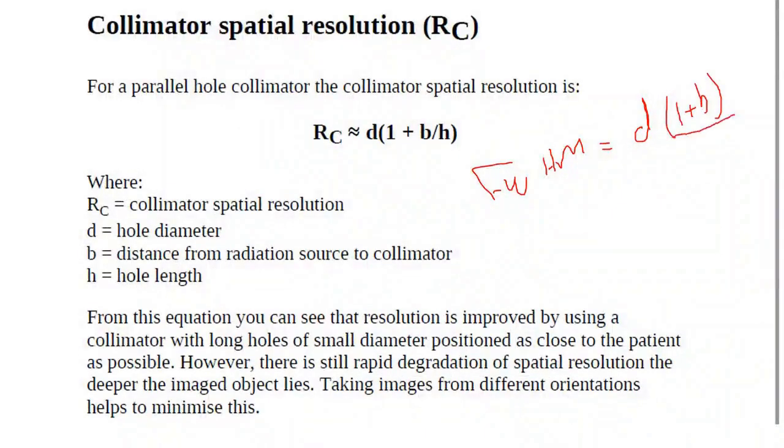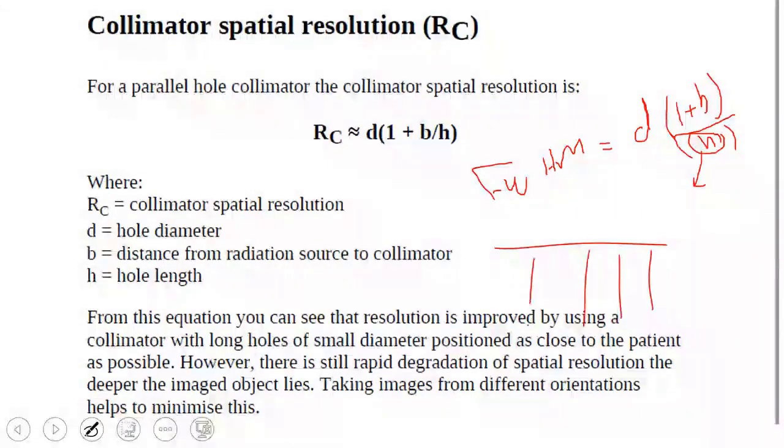This is an important concept in physics and engineering. The longer the length of the hole, the higher your resolution should be, as you might expect, right? This means that the full width at half maximum value tends to decrease. This is because of the inverse relationship between these variables. If the distance between the collimator and the source increases, your resolution will decrease, and the full width at half maximum value will increase.